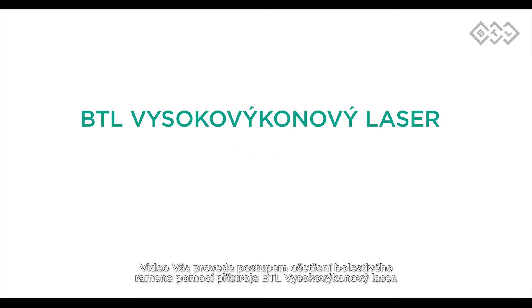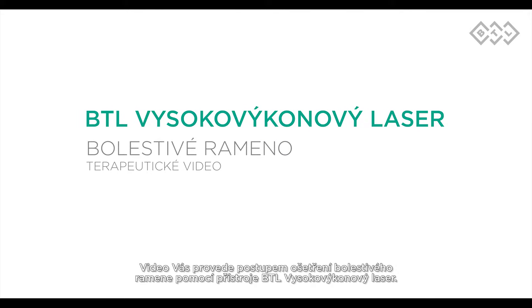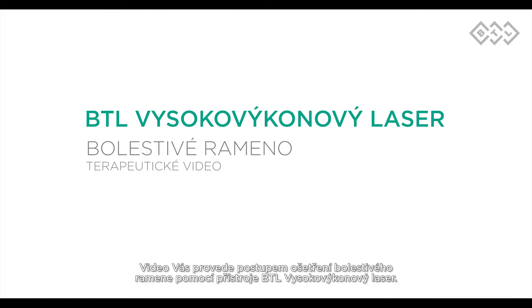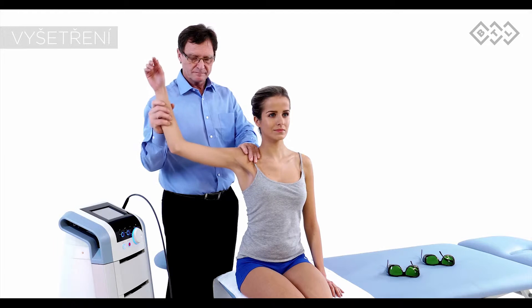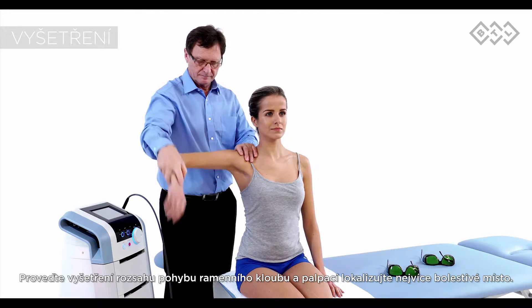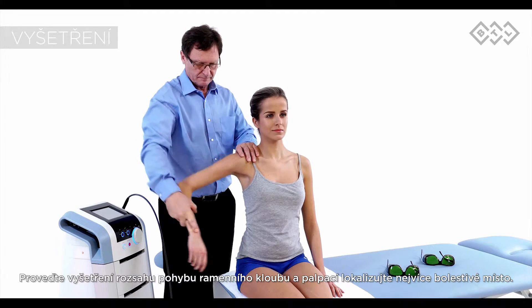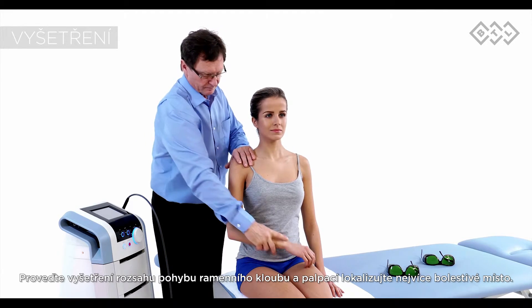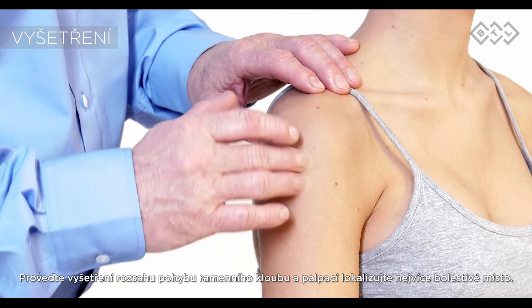This video will demonstrate how to treat a painful shoulder using the BTL high-intensity laser. Perform an examination of the range of motion of the shoulder using passive techniques and manual localization of the most painful spot.